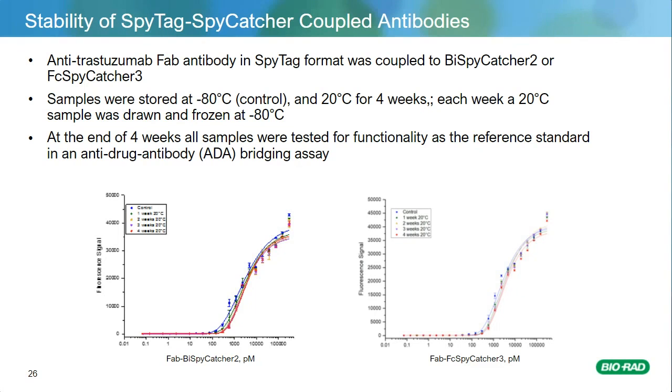In addition to reproducibility, stability is another important consideration when considering critical reagents for bioanalytical assay methods. So in this slide deck, what you essentially have is an accelerated stability study where we're using a 20-degree temperature to stress the antibodies, and essentially what you're seeing is antibodies are very robust, whether they're recombinant or natural, to these temperatures. And this is just an example.